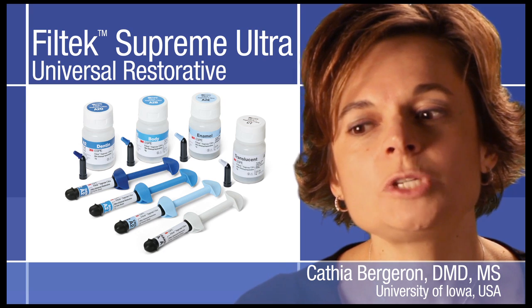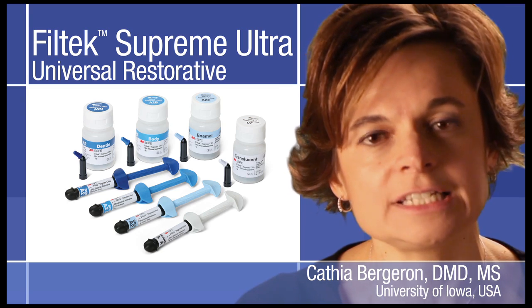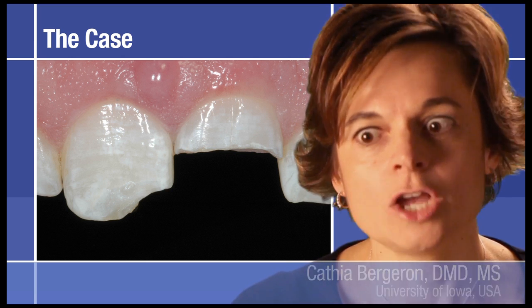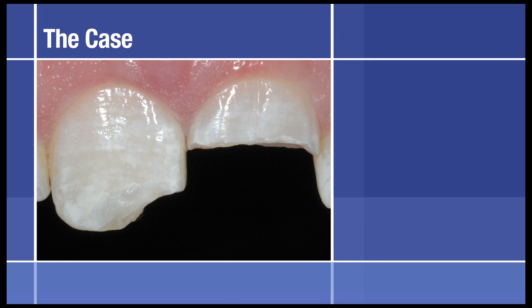Today, I want to share with you a case that I did with Filtek Supreme Ultra, a young patient about 20 years old that came to our clinic with two broken front teeth. He had fallen the night before, and he broke teeth that were previously perfectly intact.